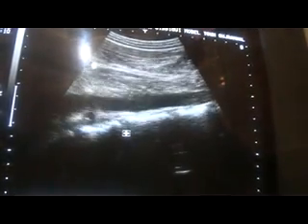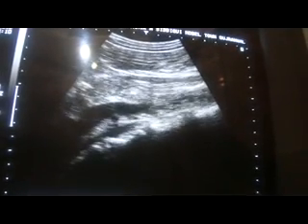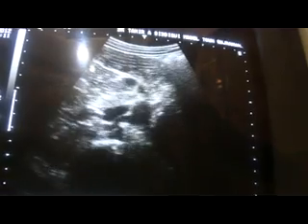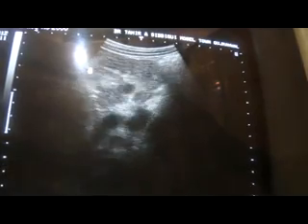This is the aorta. This is the IVC. Then this is the aorta, this one, and this is the right renal artery in transverse section, the tiny cystic area. As you will see, it enters the kidney. So up to this part, but there is one point that has come in view. What about the IVC?